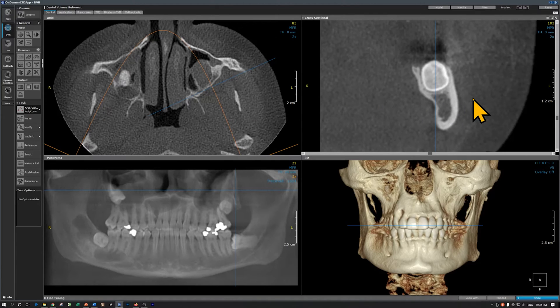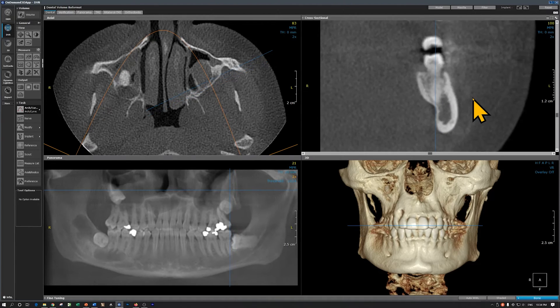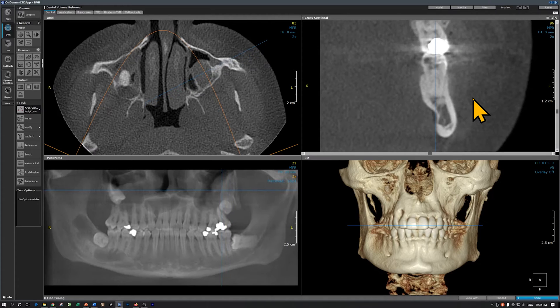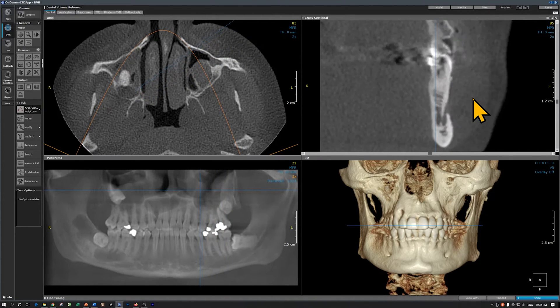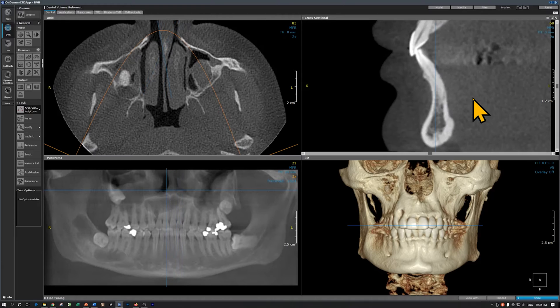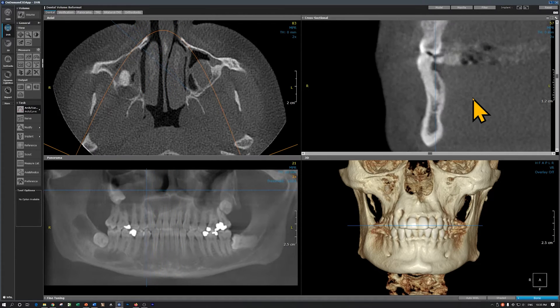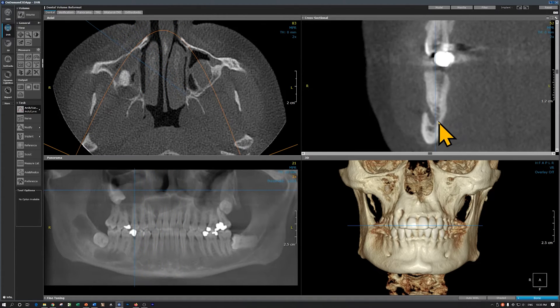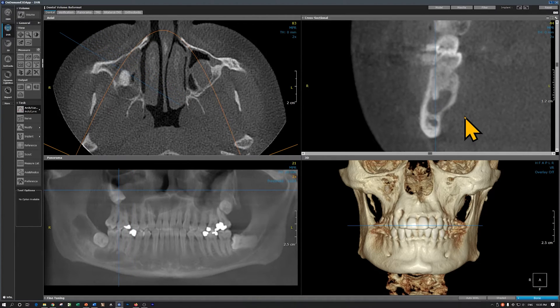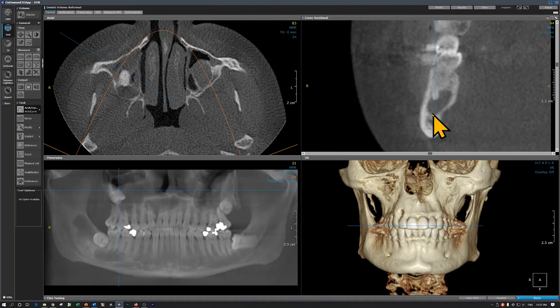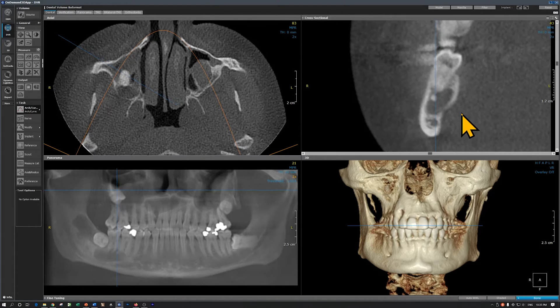This is the mandibular third molar and this area is normal. We are coming towards the anterior teeth. I'll scroll a little faster because the other lesion is in the mandibular right third molar area. That's the mental foramen on the right side. Reaching the first molar — here is the odontogenic keratocyst. That's the buccal cortical plate and this is the lingual cortical plate. See, for the size of this lesion, the cortical plates are not expanded — that's the tunnel-shaped lesion.